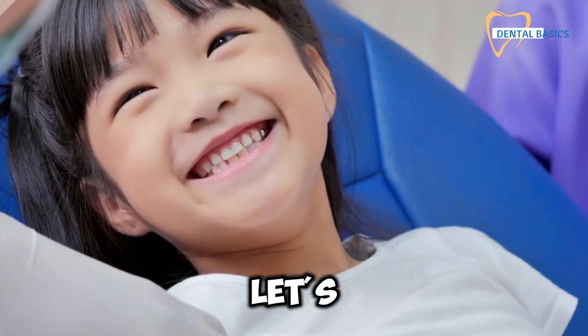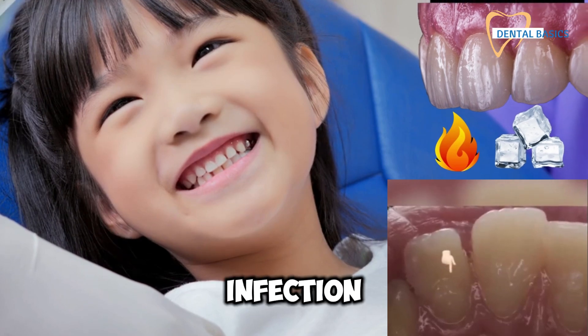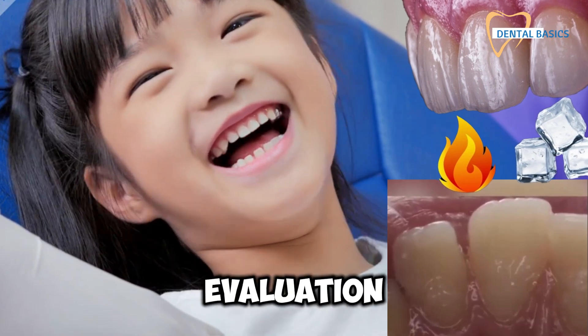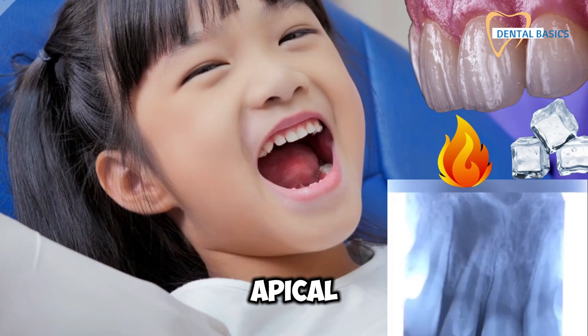First up, let's talk about diagnosis and case selection. It's crucial to assess the tooth's vitality, the extent of infection, and root development. Remember, a precise radiographic evaluation is your best friend in determining the root's length and the degree of apical closure.